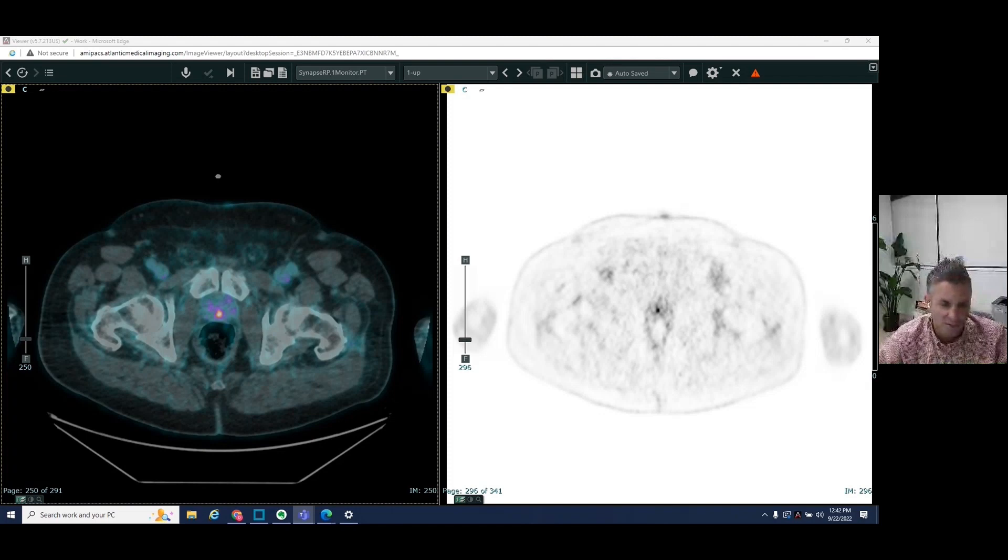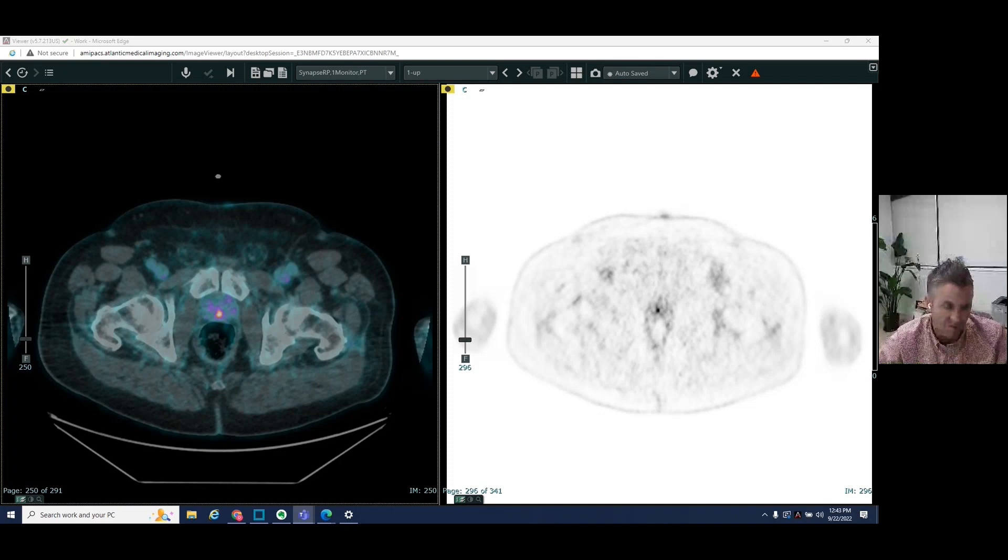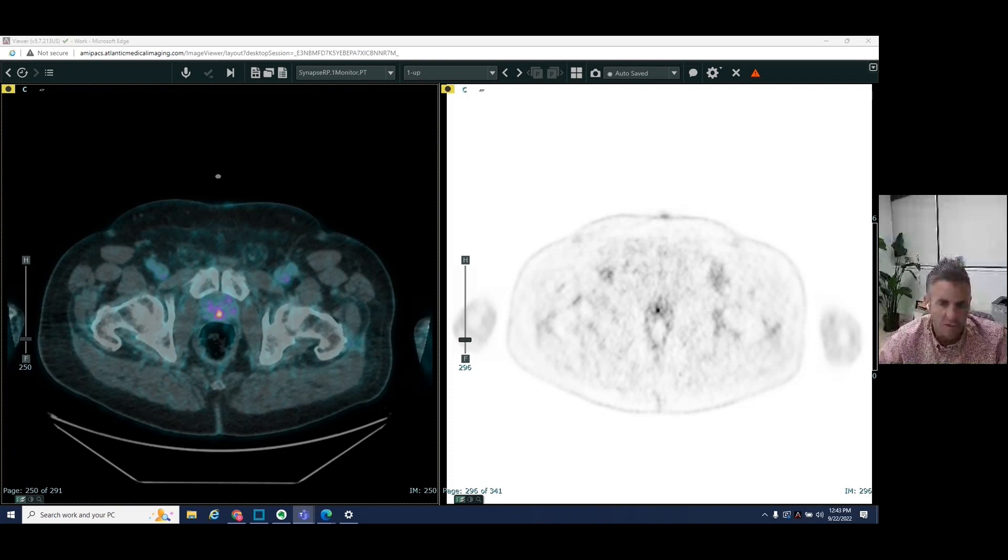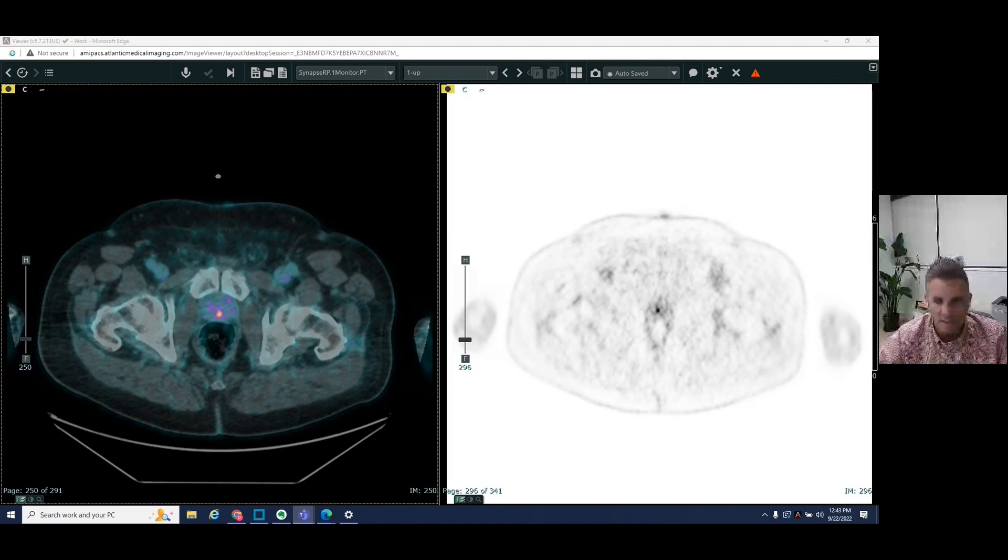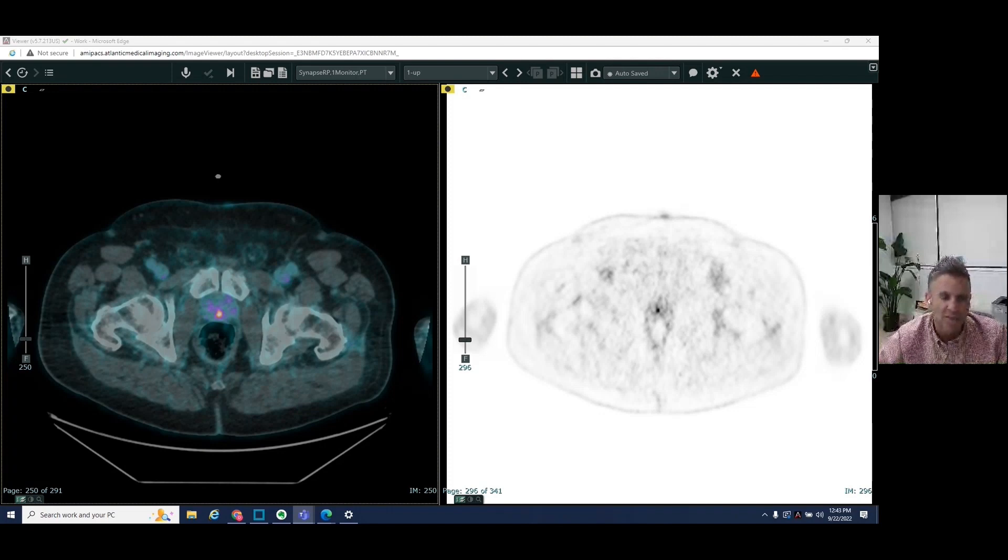And so this patient did have an increasing PSA level, and the patient was therefore sent to us to look for a recurrence. So the type of PET CT that we are doing here is a PSMA PET CT.